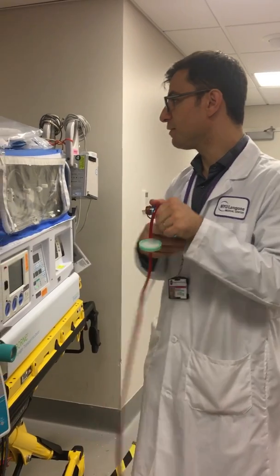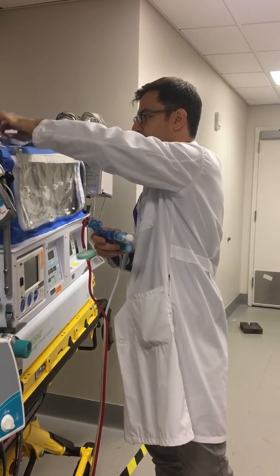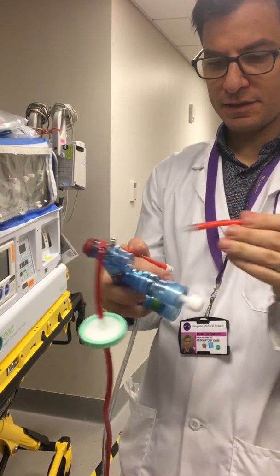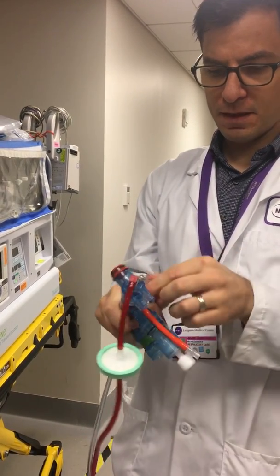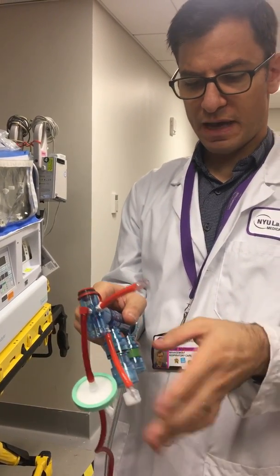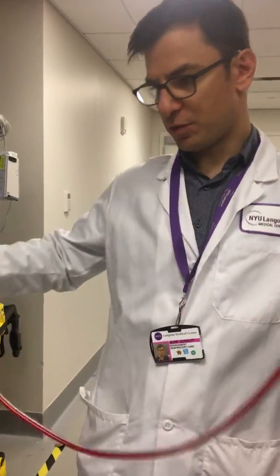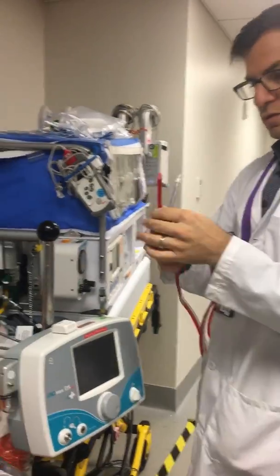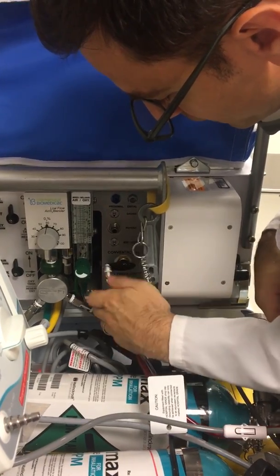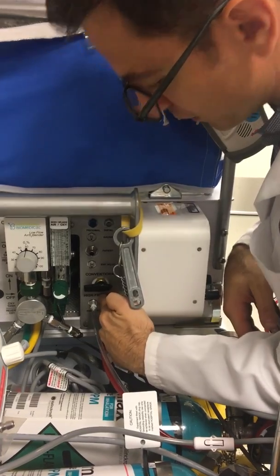Down here we have two orange line connectors for delivery. We're going to deliver underneath and we're going to sample to the side here. So we have our delivery and our sample. We're going to connect to our transporter down here — red to red and clear to clear. We're going to have to point our gas flow towards high frequency, but we're not going to go there just yet.